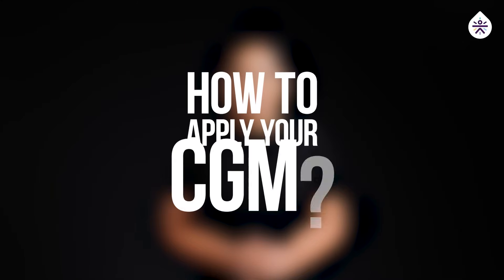Welcome to the CGM application tutorial. Let's get started.